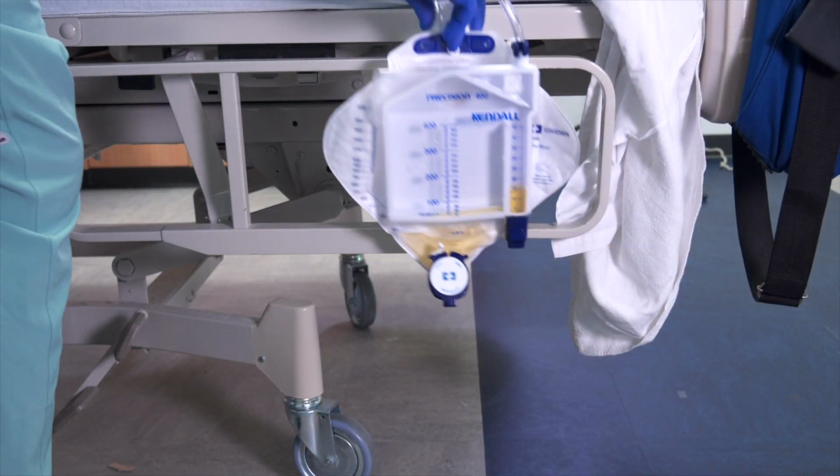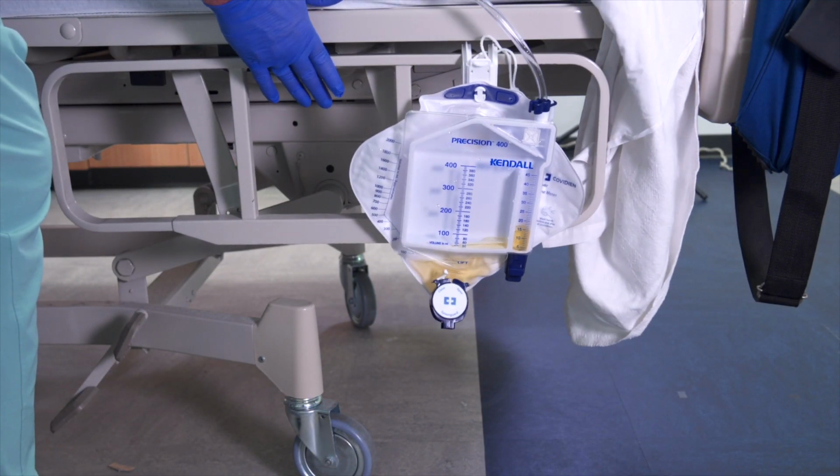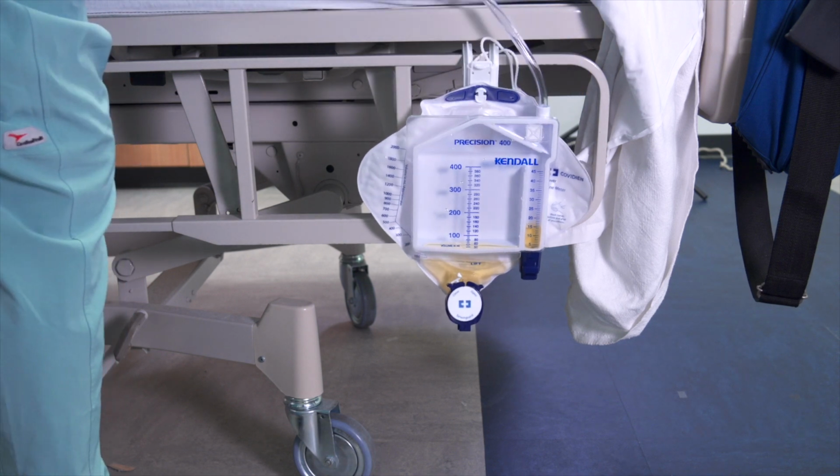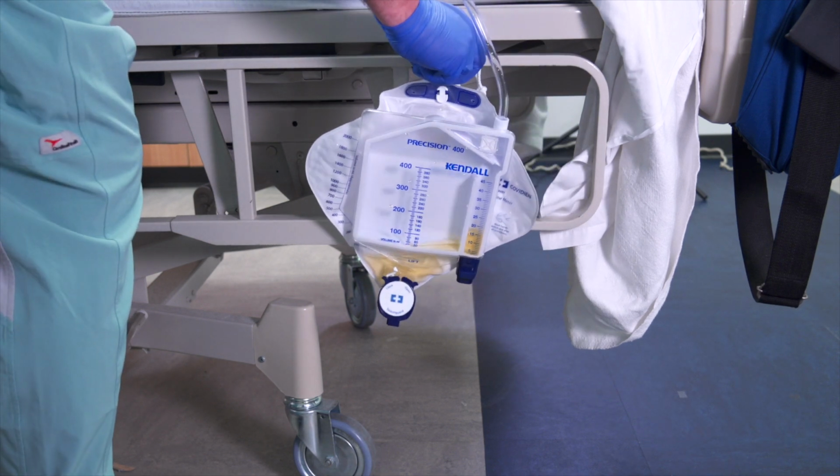Once the catheter is secure, hang the drainage bag on the rail or footboard of the bed. The drainage bag should always be below the level of the patient's bladder to allow adequate urine flow. Reposition the patient for comfort, placing the bed in the lowest position.